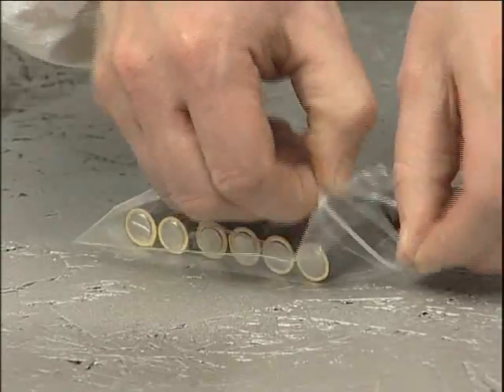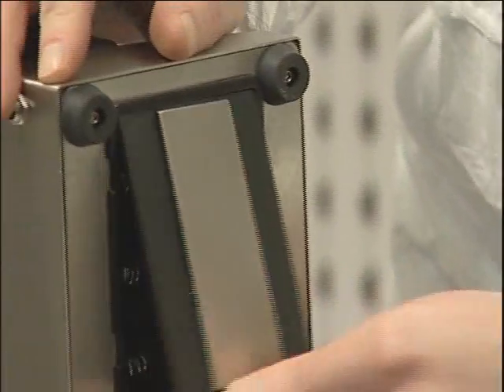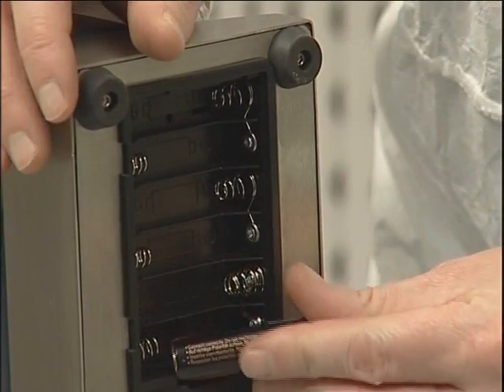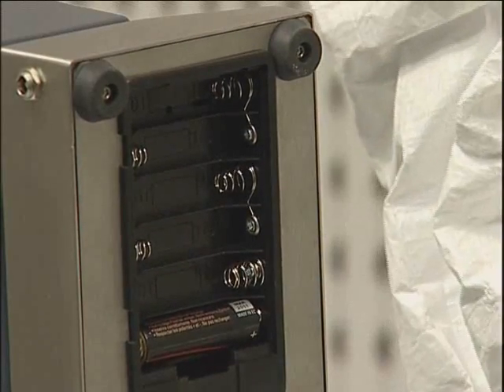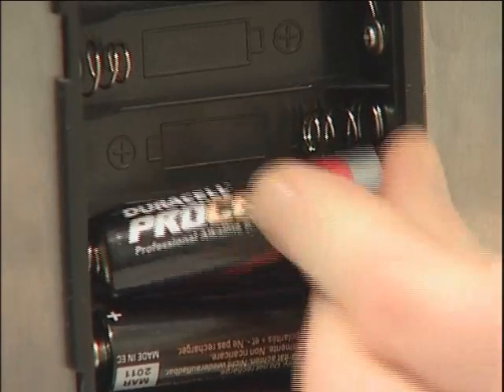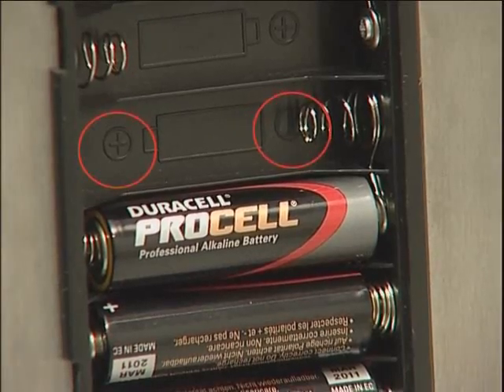Testers are supplied with batteries packed separately. Please note rechargeable batteries are not suitable for use with this instrument. These must be installed prior to use unless it's the intention to power the unit solely from a mains supply. It's important to strictly observe polarity when fitting batteries and ensure that they are correctly located.